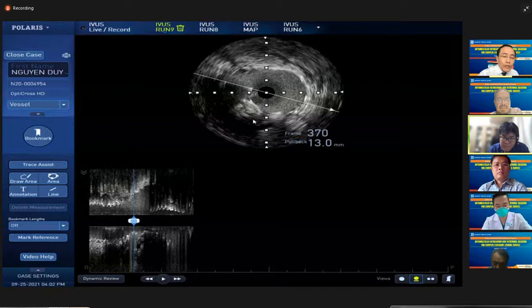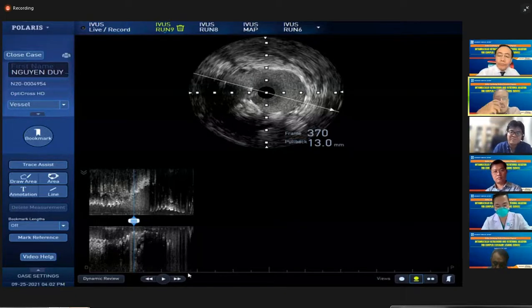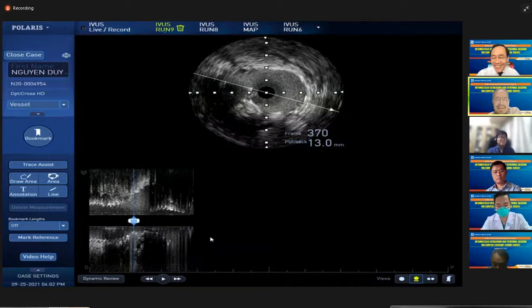It looks like proximal, huh? Yeah, I can tell that, similar to Dr. Kuramisu, it is not a distal, but I'm not sure about the middle or proximal, frankly. So the second case maybe it's quite difficult.